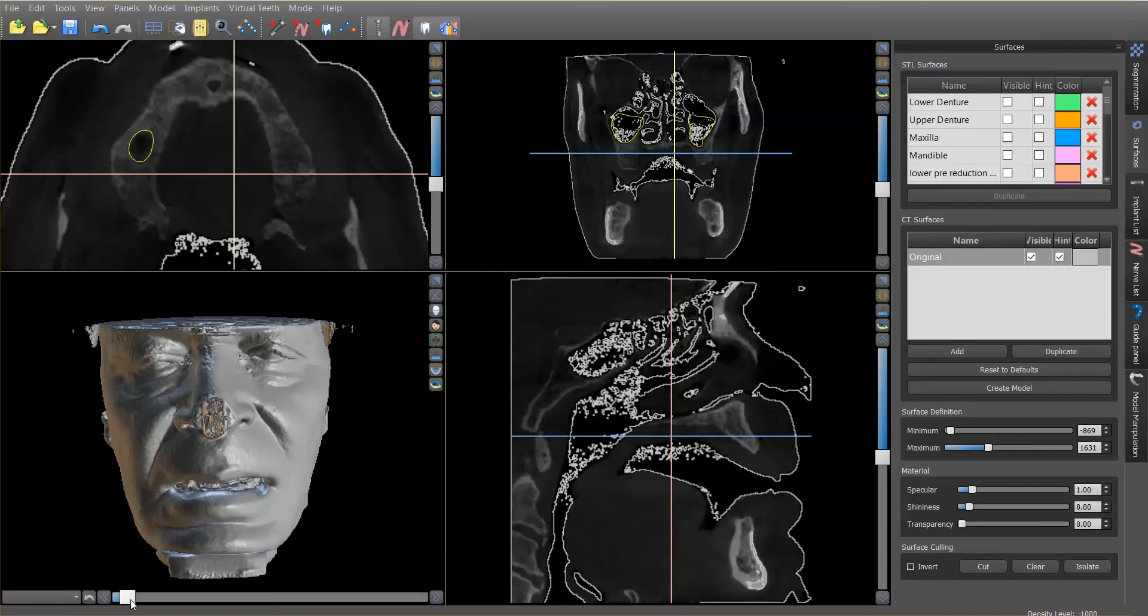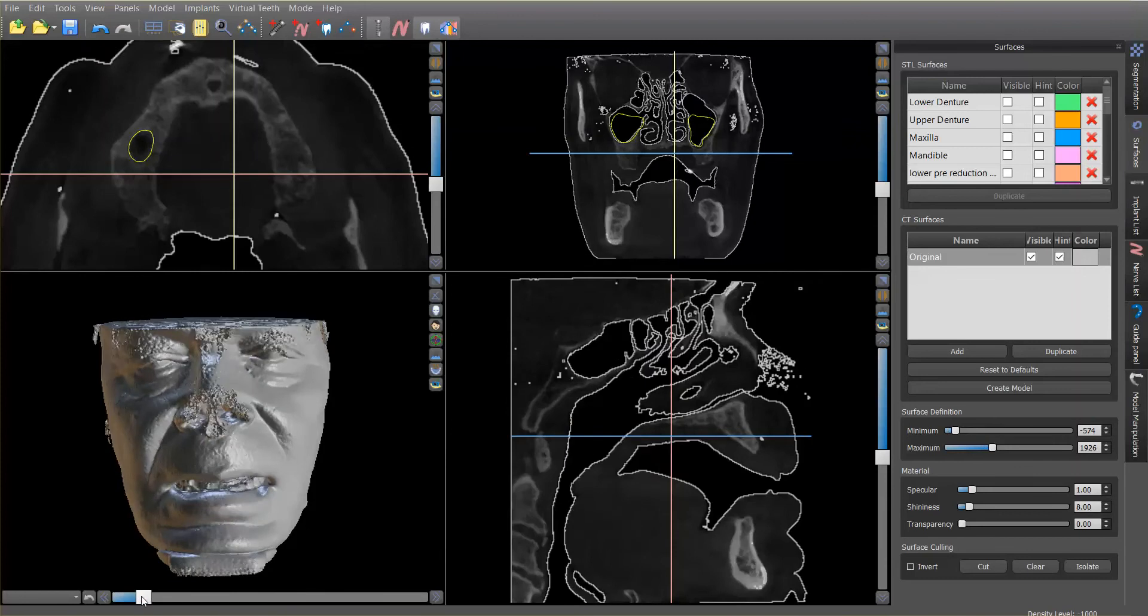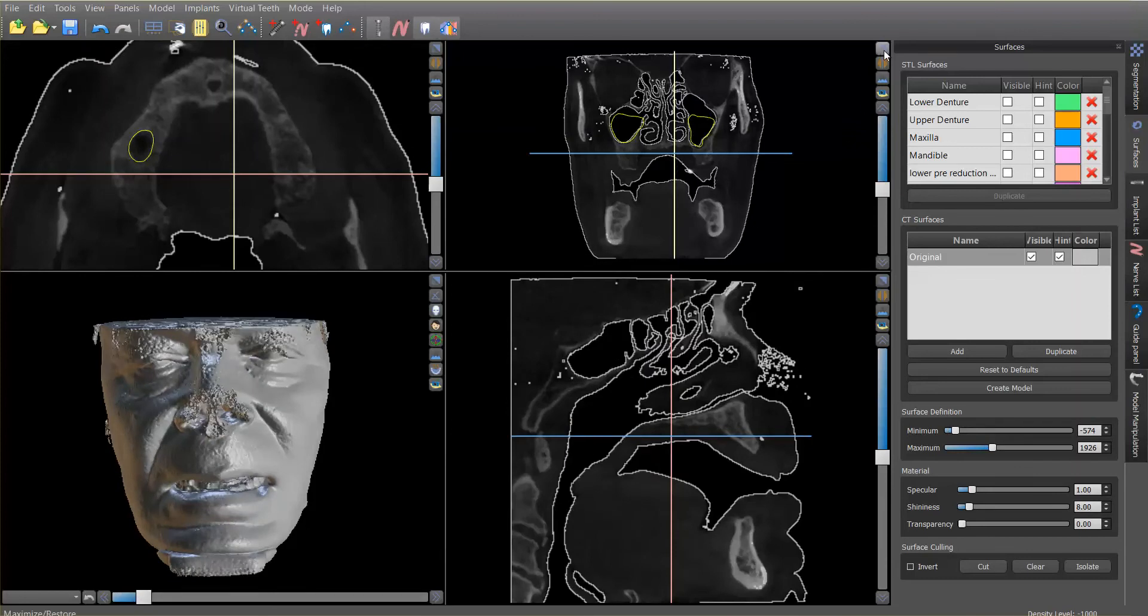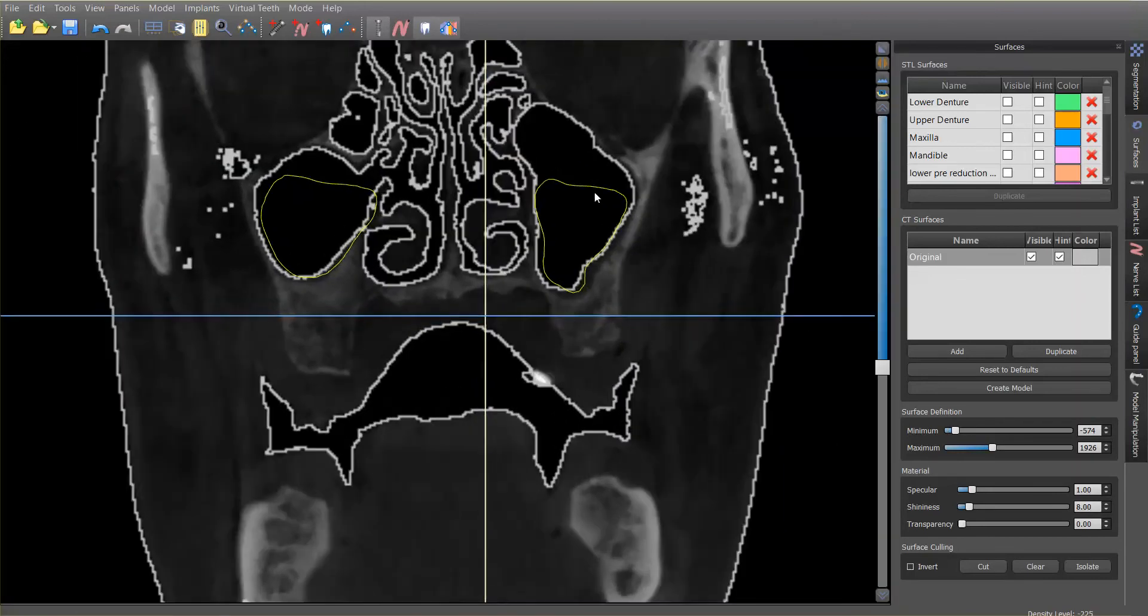And so what I would like to do is adjust this to the point where basically all the air is pretty much showing. So this is what I'm after, and you can see right here how the sinuses are very well detailed here.